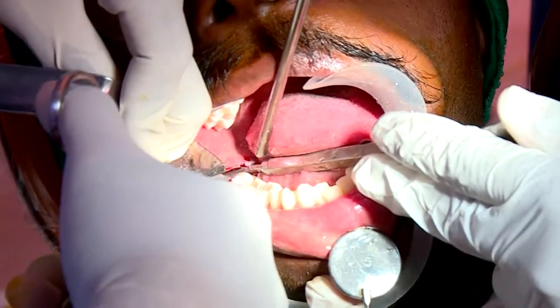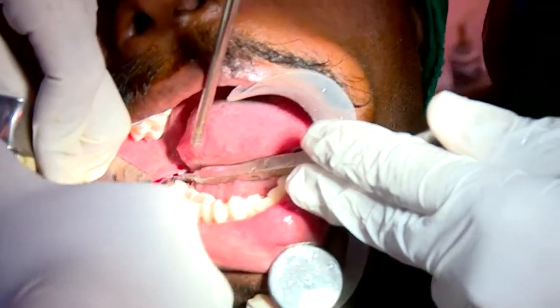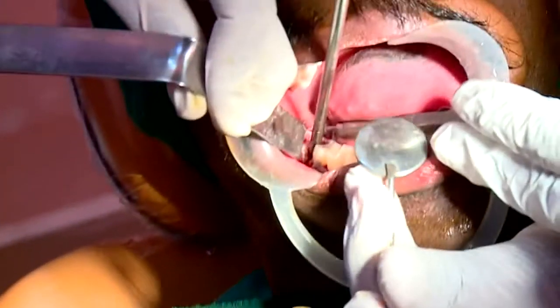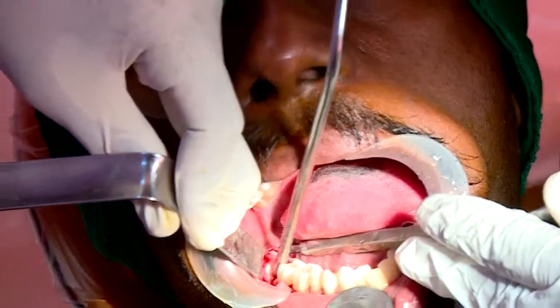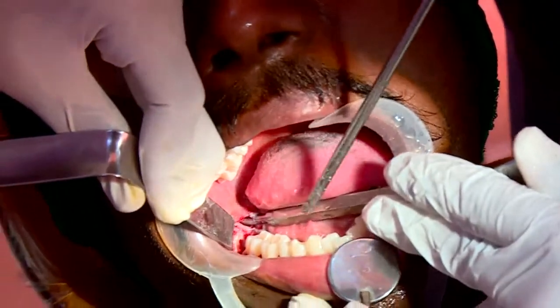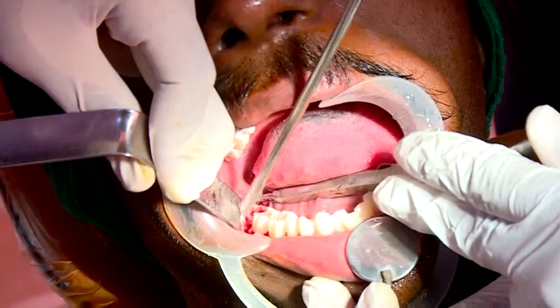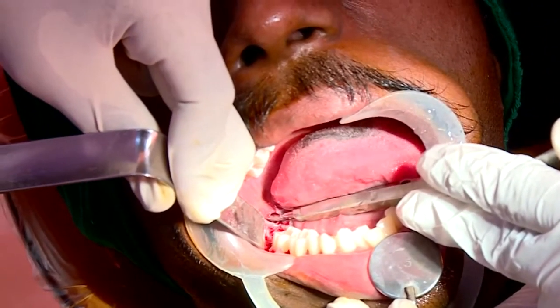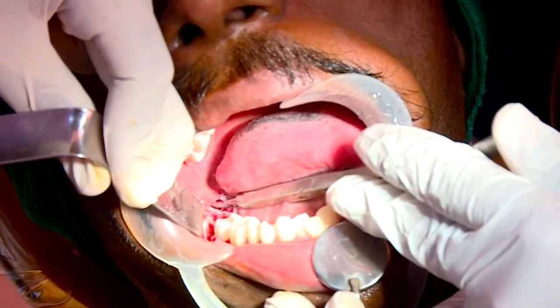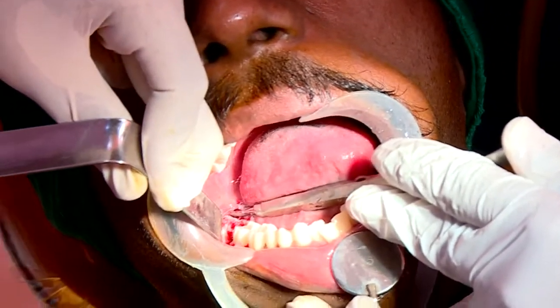This is the superior part, distal aspect of the crown. Okay. Once this crown is removed, the inside part, the mesial aspect, which is wedged below the contour of the second molar, is clearly visible. Okay. So I'm just inspecting what happened, why it is difficult to remove it. You still see the very limited amount of bleeding that is there. Okay, good accessibility and visibility.